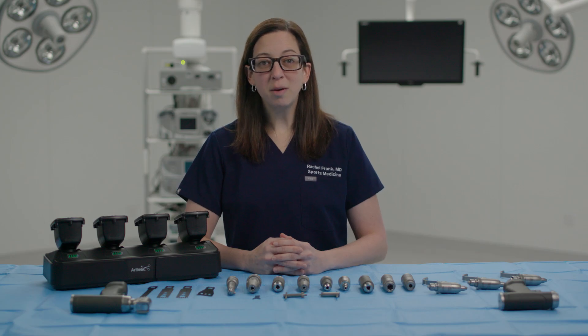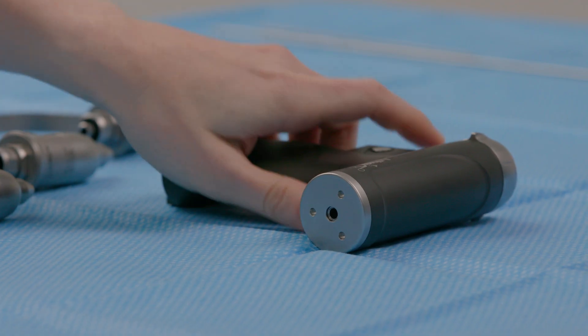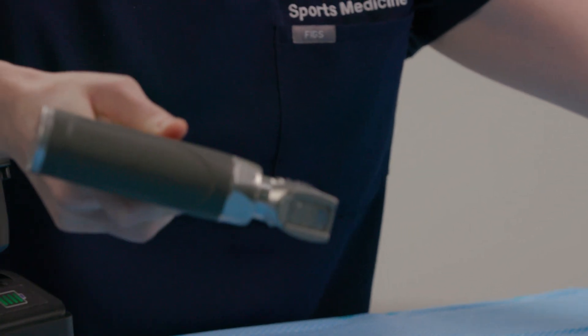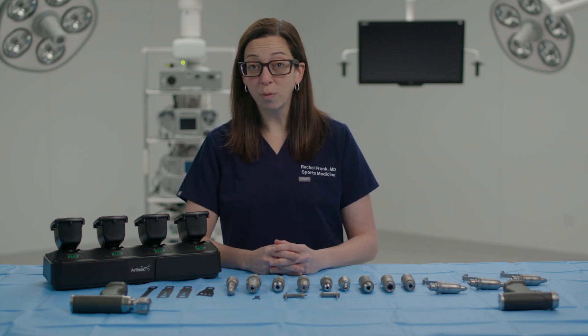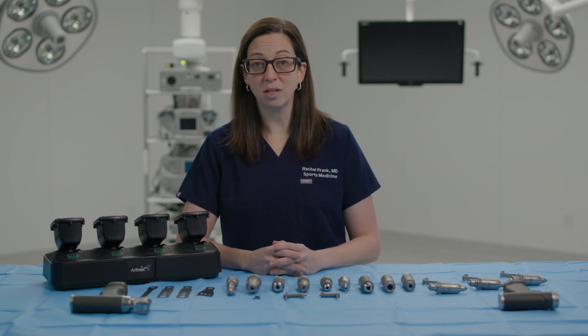The Synergy Power System is a medium and large bone system comprised of two handpieces: a dual trigger rotary drill and a dedicated sagittal saw. These two handpieces are designed to cover a wide range of orthopedic applications, including sports, arthroplasty, and trauma procedures. Both handpieces are ergonomic, lightweight, and durable, making them easy to use and comfortable for all hand sizes, even during long and complex cases.